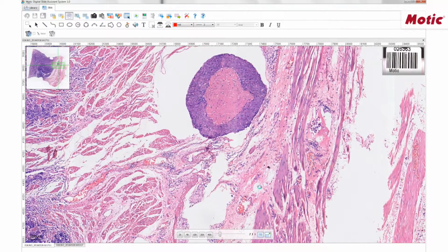Comparison between multiple digital slides is another interesting tool on this software. In fact, this option can be extremely useful, for instance, when the comparison of similar sections with different stainings are required, or when similar sections from the same patient have to be contrasted from time to time. Synchronization of the images can facilitate their comparison, but can also be something useful to make the image processing easier.